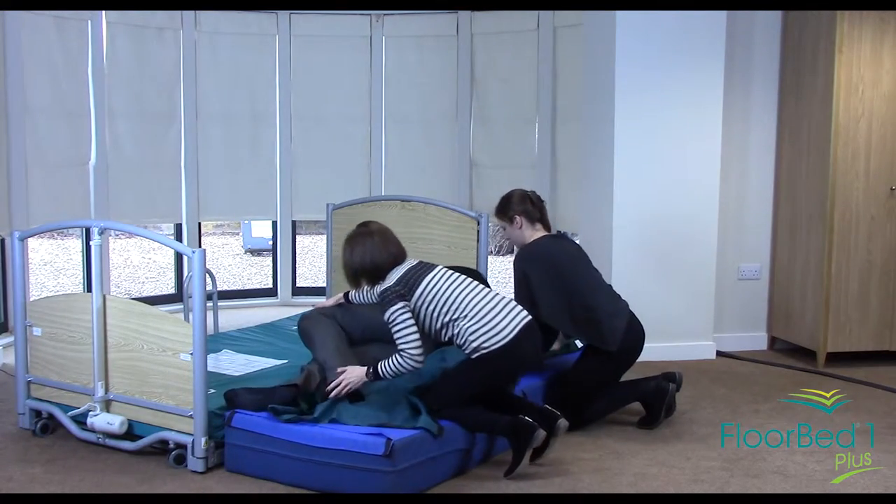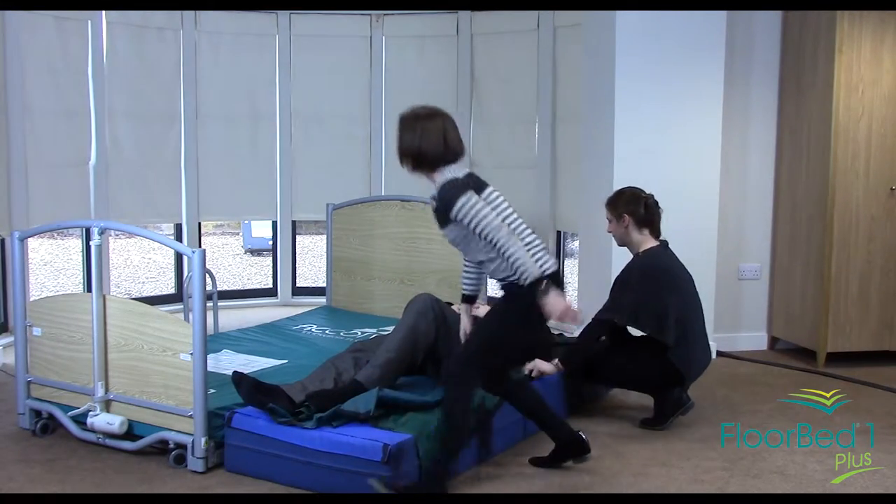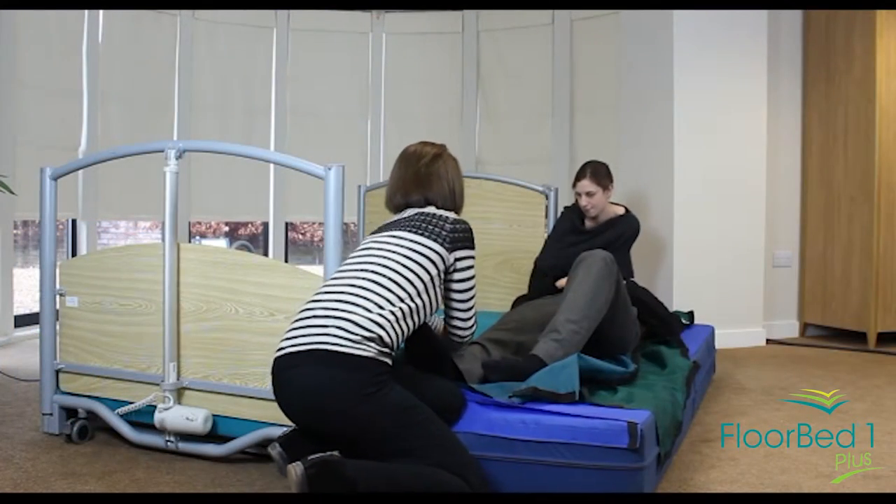At this point we will roll that back onto the safety mat, come round both edges, and pull the sliding sheet out.